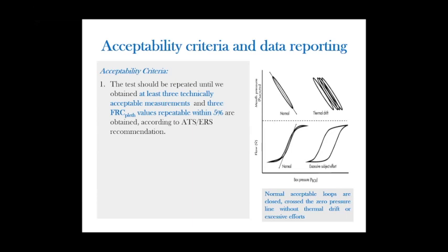doctors and patient diagnosis. For the acceptability criteria for the body box, the test should be repeated until we obtain at least 3 technically acceptable measurements, and the 3 FRC plethysmography values should be repeatable within 5% according to ATS/ERS recommendation.